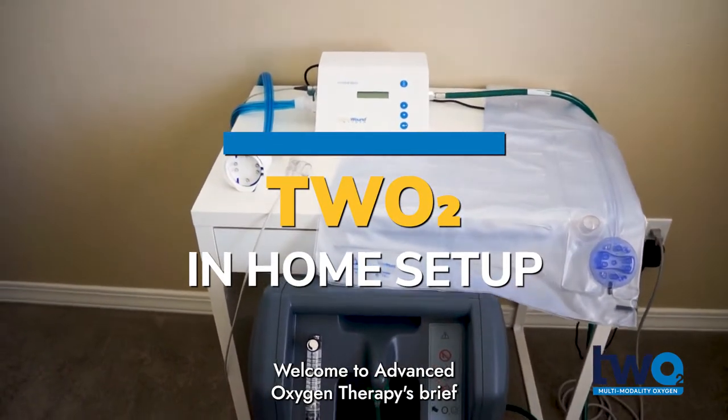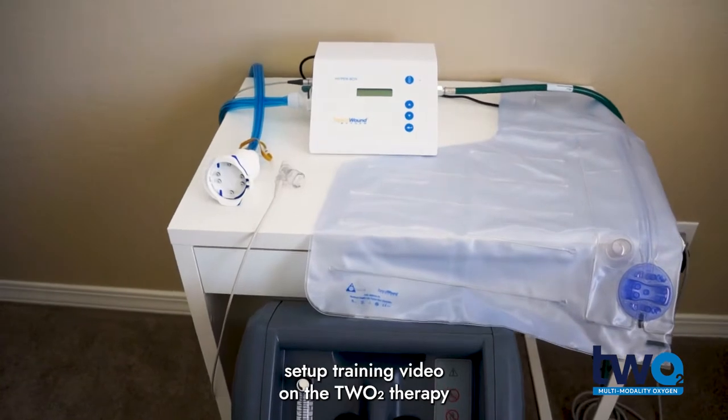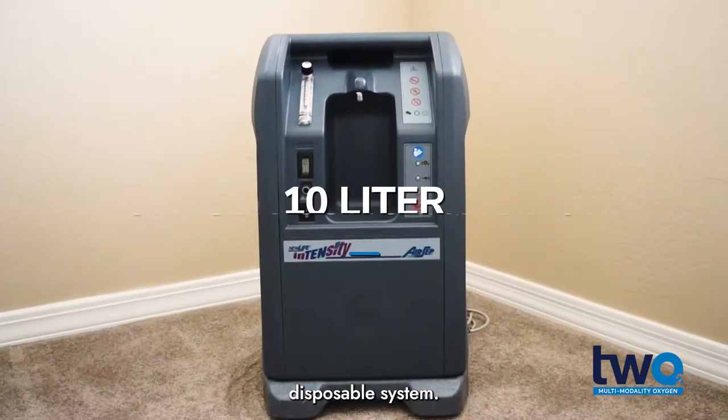Welcome to Advanced Oxygen Therapy's brief set-up training video on the TWO2 therapy disposable system.